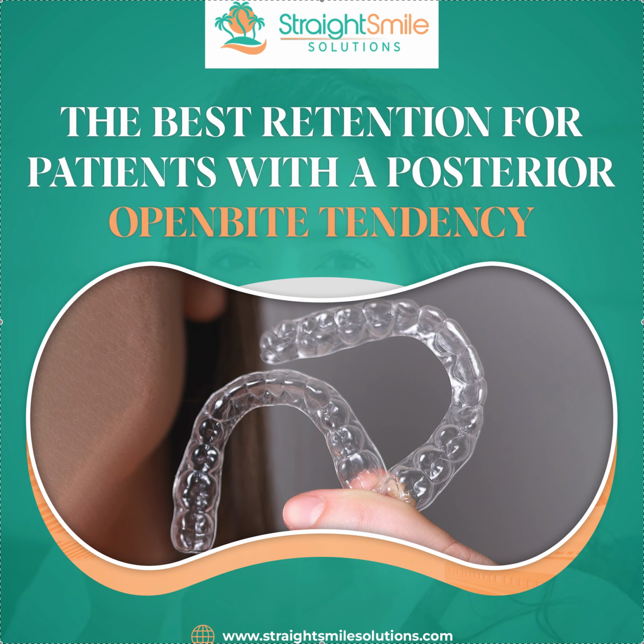But I thought that was a really good point because they said that when you have night guards, they're equilibrated and articulated so that when you close down on the hinge axis, the back doesn't touch first. But that's not the same way. We don't use an articulator and we don't equilibrate these. They're just plastic. So when you close down, the back teeth touch first, and then you have to auto-rotate your jaw in order to close your lips over them. And that is why you have the additional pressure. And if you have big masseters, strong bite tendency, you're going to get intrusion of the back teeth.